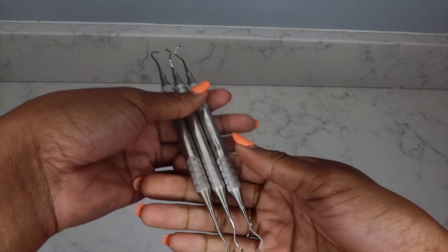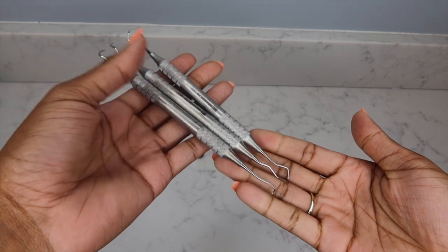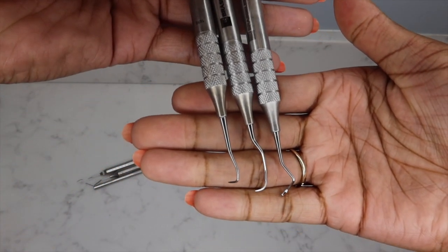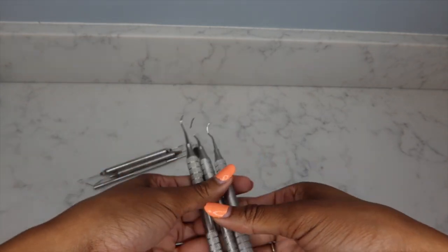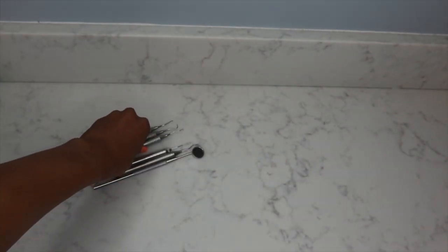Of course I have to have a mirror, an explorer, and a probe — those are staples in every instrument pack. Along with those, I have a combination of sickles, Graceys, and universals in my kit. I love the Nevi 1H5 for anterior and stain removal — absolutely have to have that. Also the 204S sickle for above the gum line on posterior teeth, and the 13/14 and 15/16 posterior Gracey curettes. The 11/12 is great for root planing — I love it for its slim design.